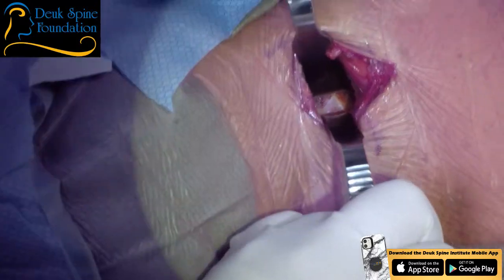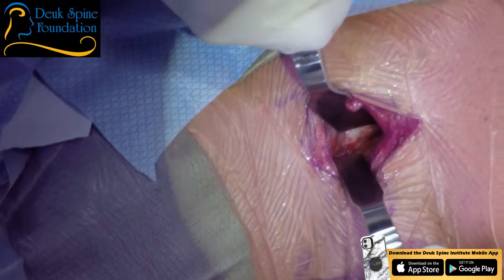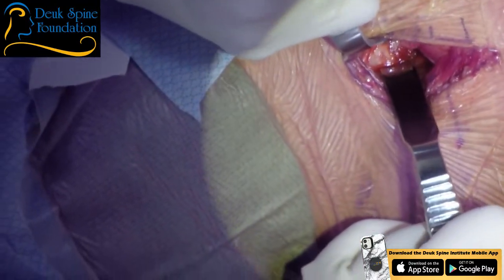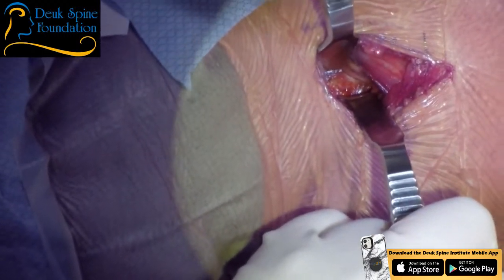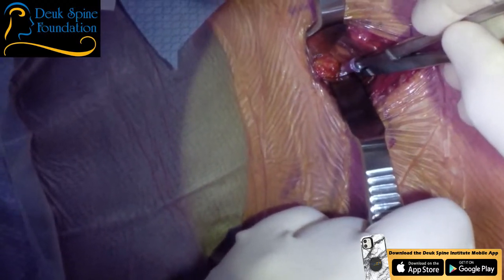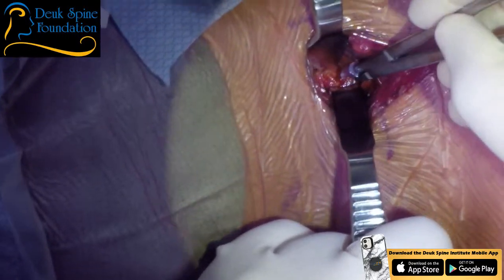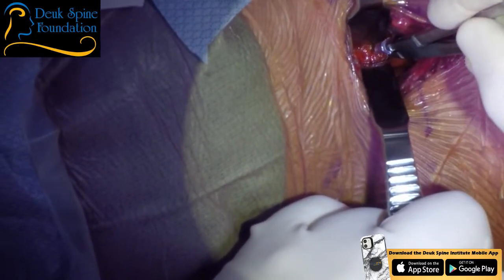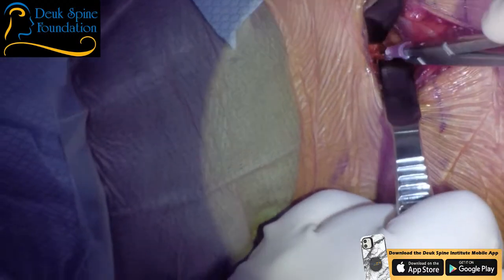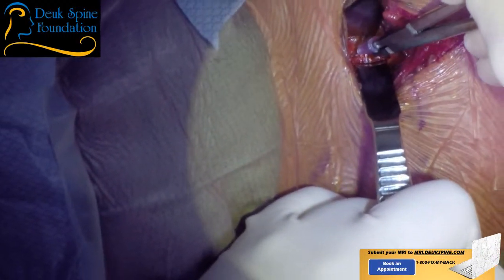Okay. So let's try to tag 5-6 and see if we can see it. Dr. Patel, that requires you to move north. Keep going. All right, so we know that's 4-5. I believe that's 5-6 right there. We know that's 4-5. That's 5. Bipolar.